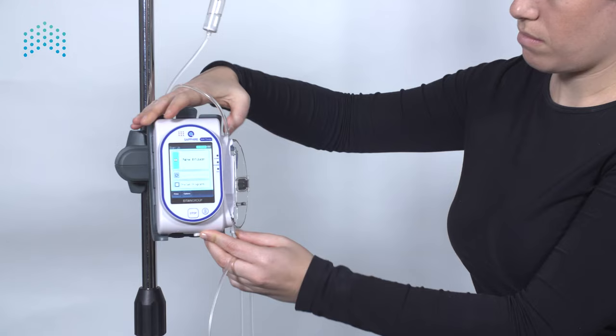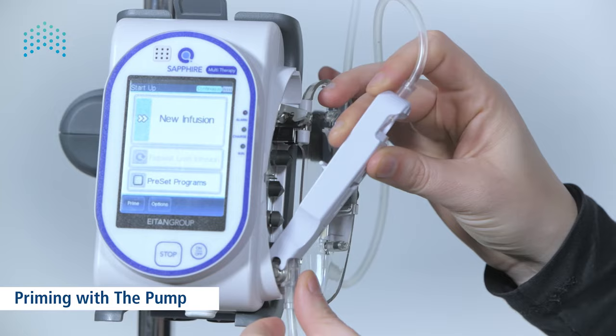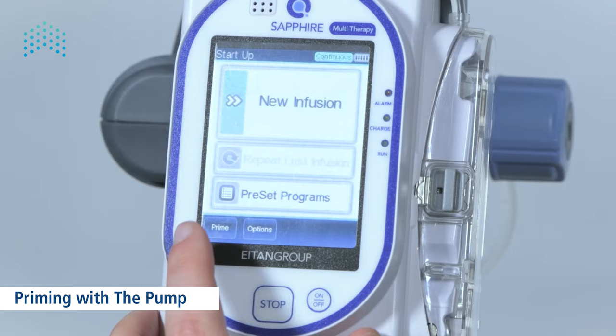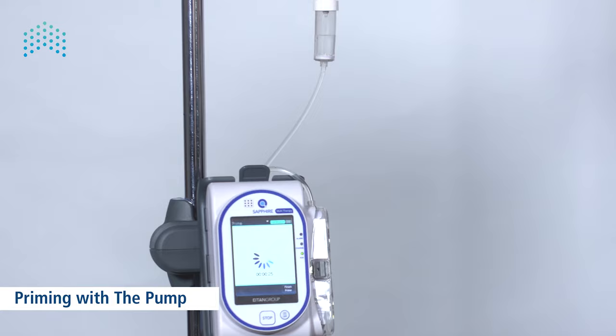Once priming is complete, insert the cassette into the pump — place the bottom part first, then click the top part into the lock. Alternatively, to prime any set with the pump, first attach the administration set to the pump by placing the bottom part first and clicking the top part into the lock. Then press the prime key on the toolbar.